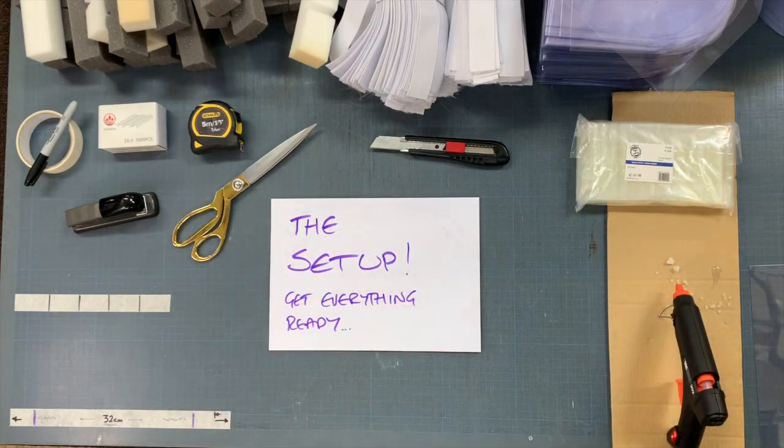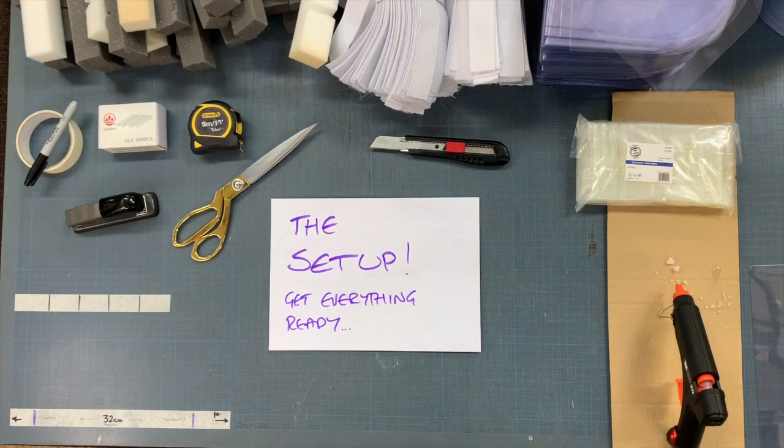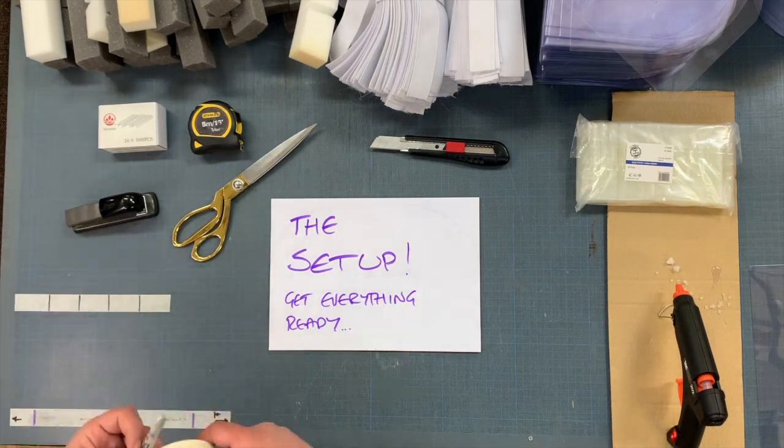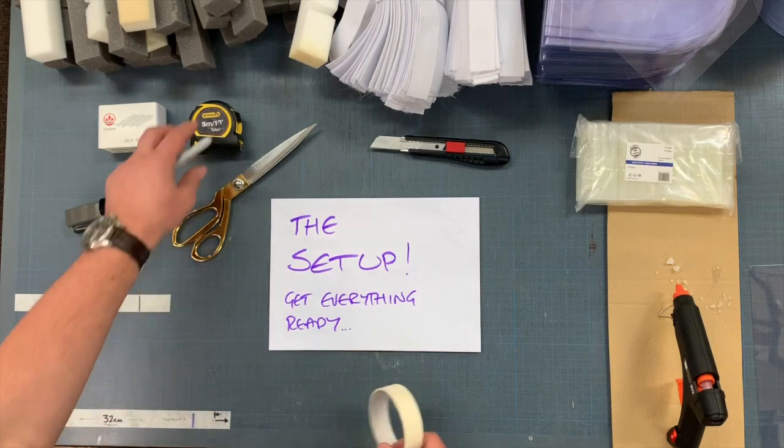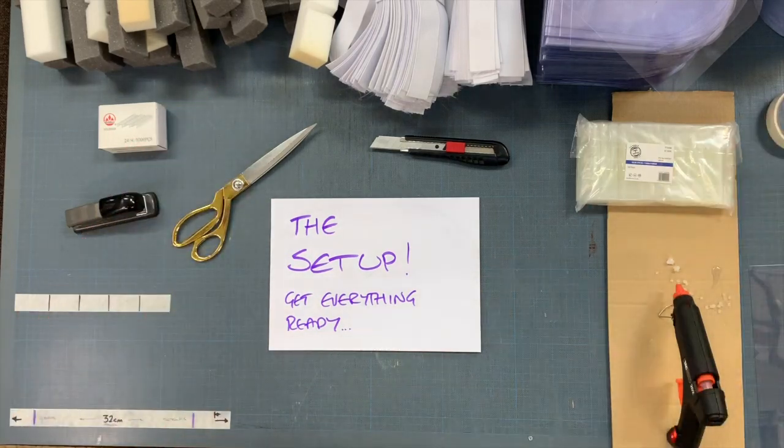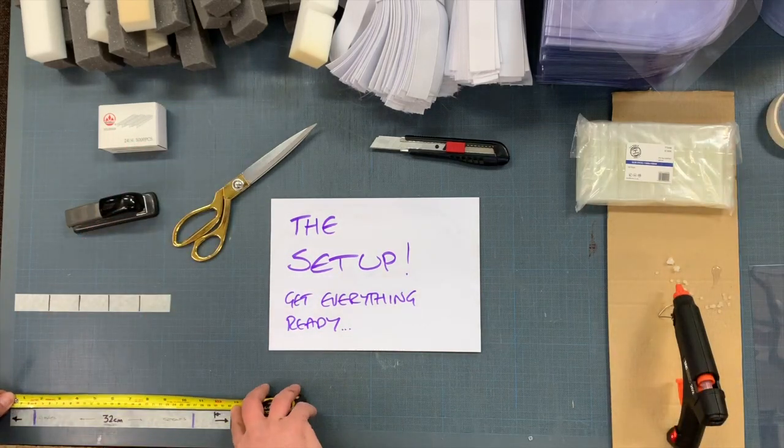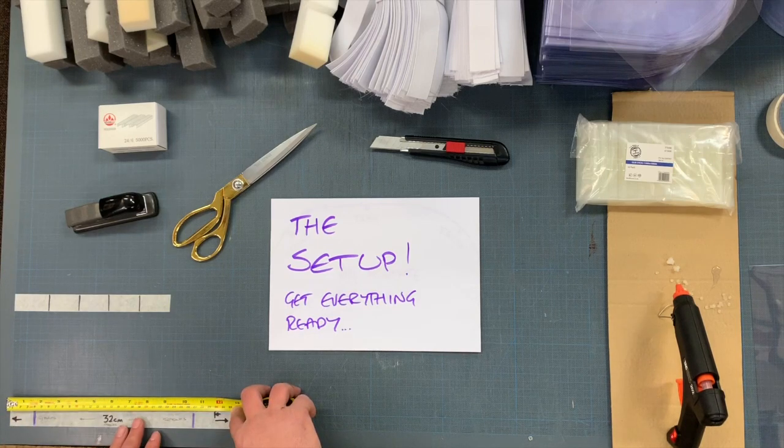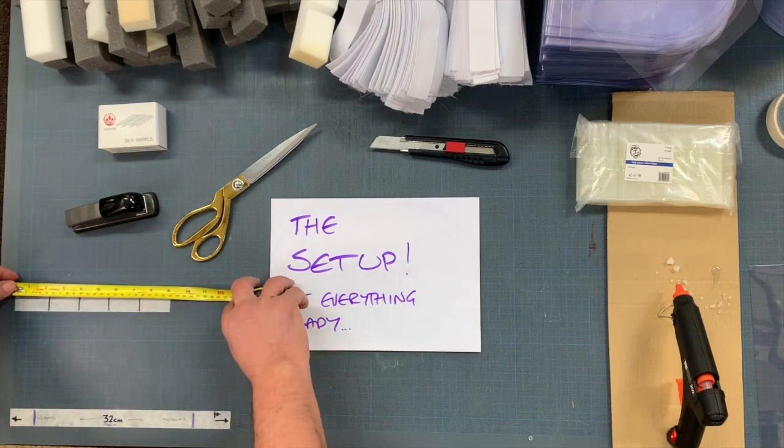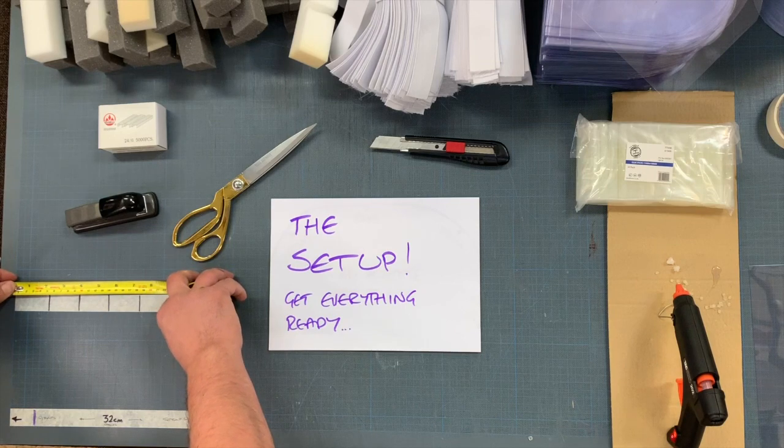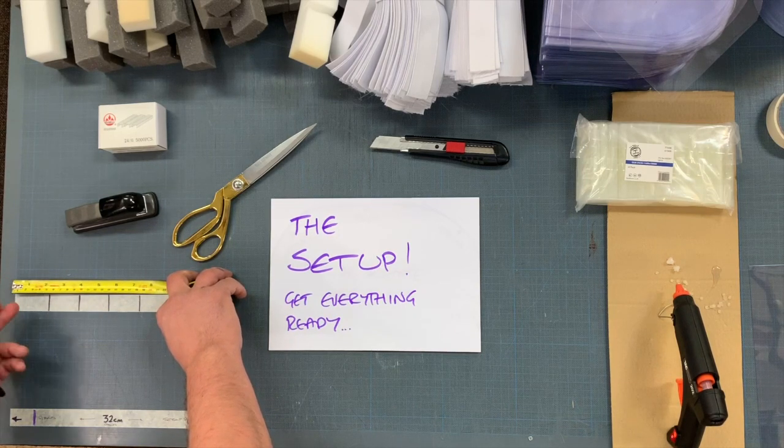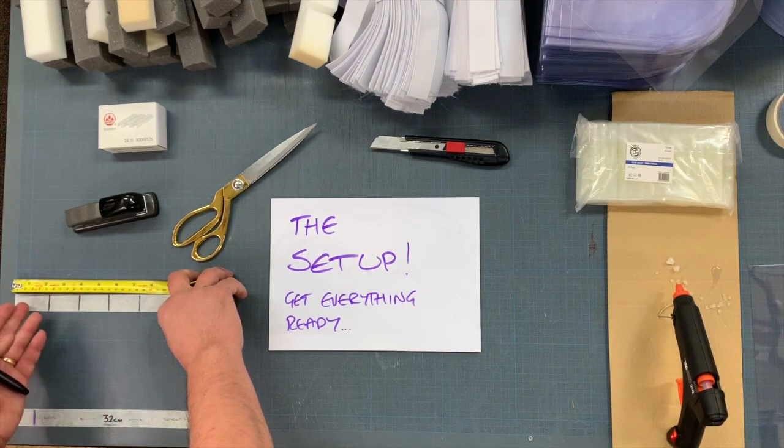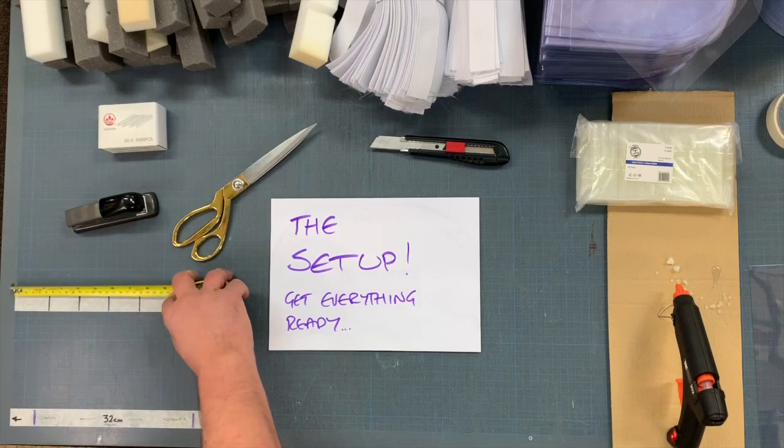It's important to get the setup right first. I've used masking tape to create two strips here. One strip is 32cm in length for cutting the elastic straps. The next one is 23cm in length for your foam blocks. I've then divided that into five sections with four lines.